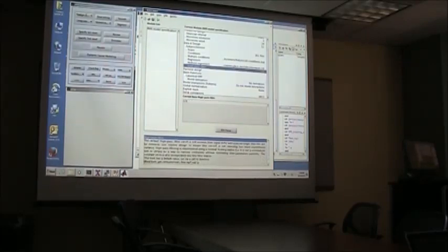Another important thing is you also select a high-pass filter. I mentioned this at the end of last week. It's sort of in between a pre-processing step and part of your model. You want to filter out low-frequency noise, and this is a bit of a tricky issue, in the sense that if you set this too low, you're at the risk of filtering out information of interest, depending on your task design.